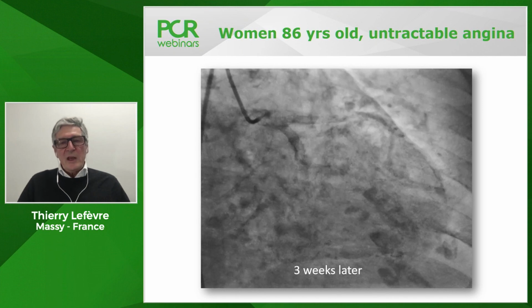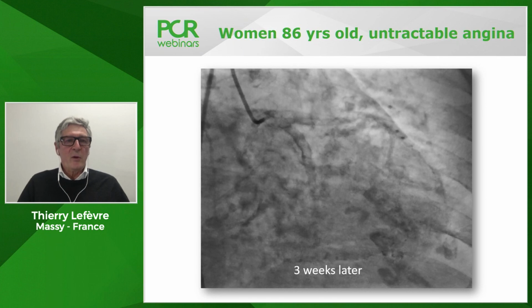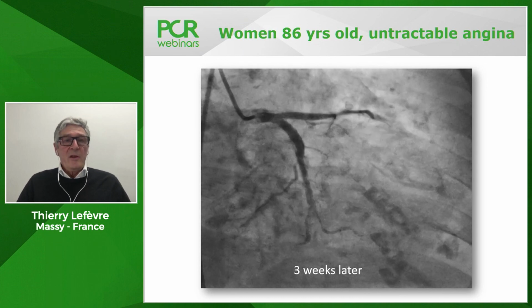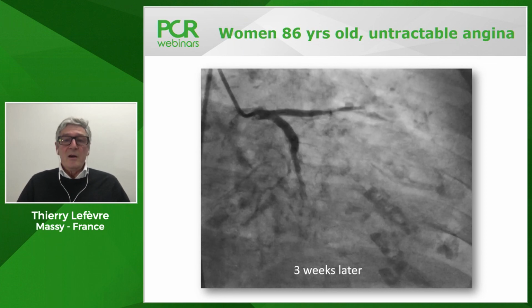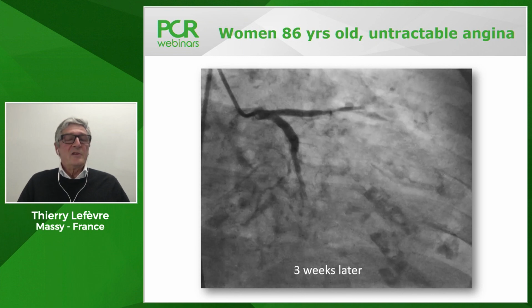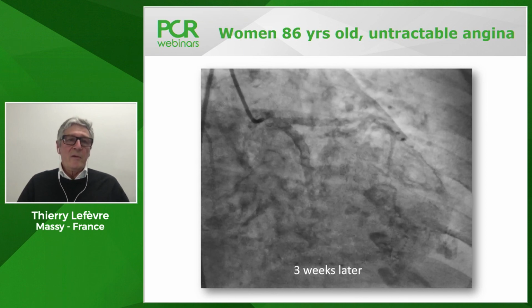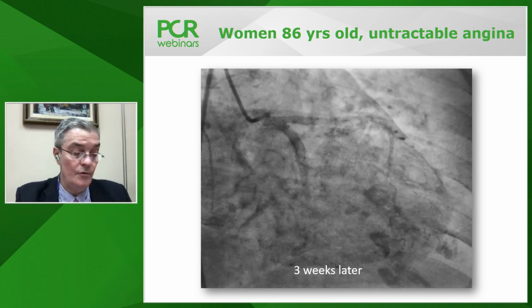But what I have to say is that sometimes you have a patient who had a stent which was implanted 5 years ago, and he had restenosis because the stent was not well opened. And sometimes you have no other way than IVL to be able to open the stent correctly. Sometimes we use a non-compliant OPN NC balloon up to 45 atmospheres without the possibility to open the stent, and then IVL can be very useful as a sequential tool to use.